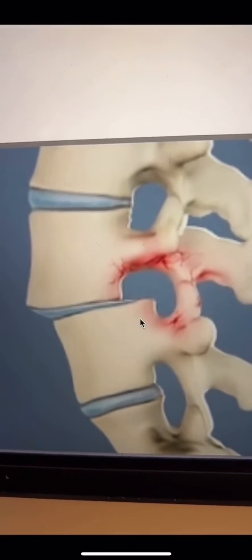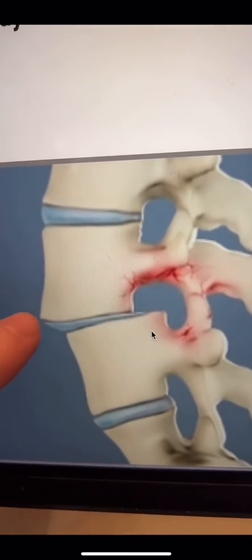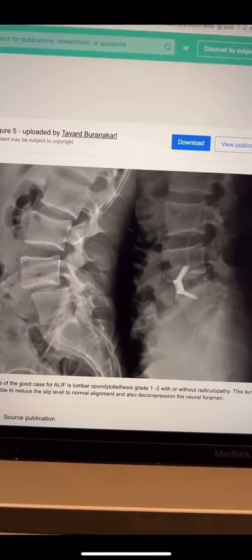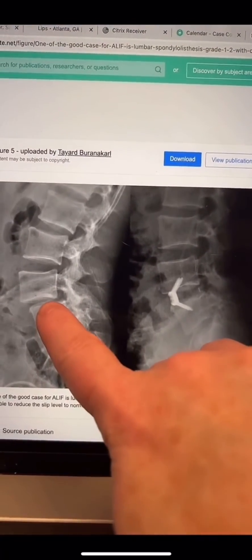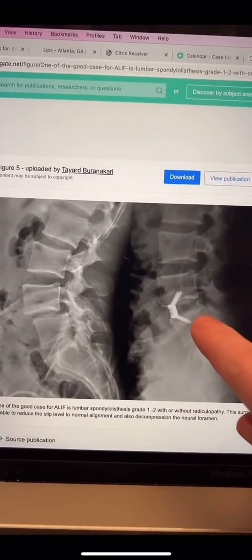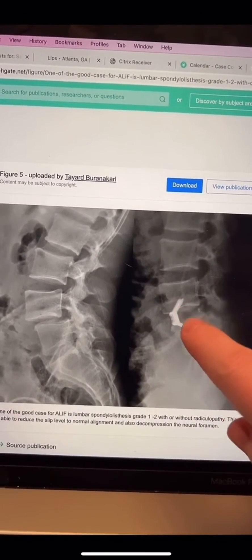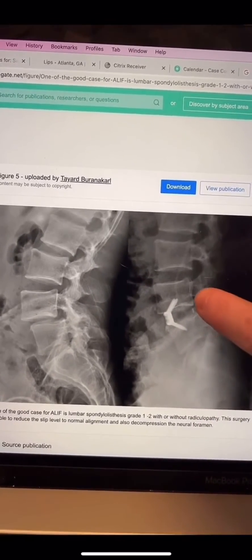Here is a visualization of a spondylolisthesis — you can see one vertebra shifted on the other. In my opinion, the best approach for these cases is a front-and-back spinal fusion. This anterior approach restores disc height, lordosis, and alignment. Because the slippage is mobile — as shown in the flexion-extension films — it also needs posterior stabilization. A laminectomy alone, as some suggested, is not appropriate because it will further destabilize the spine.